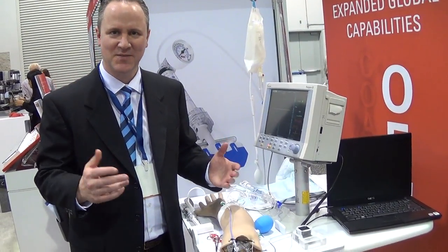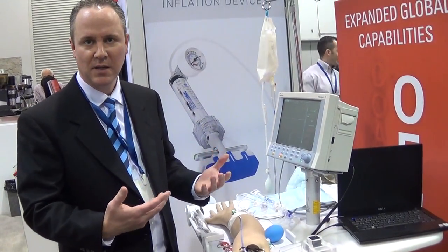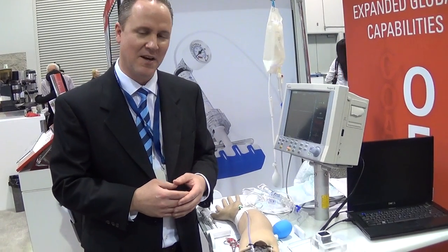Hi, I'm Scott Sidwell from Merit Sensor Systems, and I'll be demonstrating some of the reliability of our blood pressure sensor — how it's been designed to withstand some real-life, real-world application, brutal conditions, even in a hospital setting.